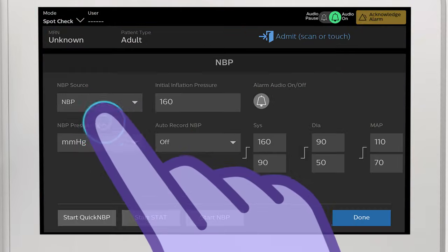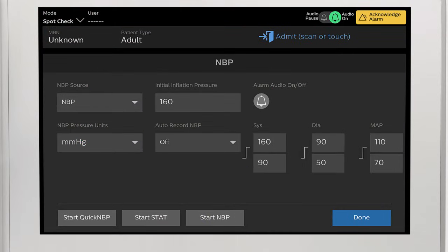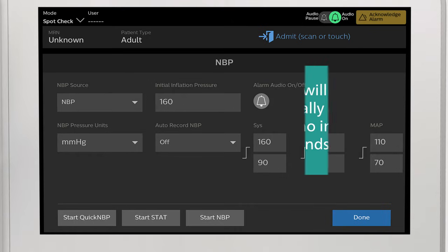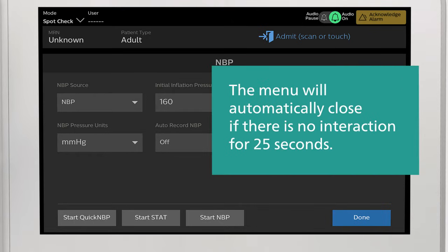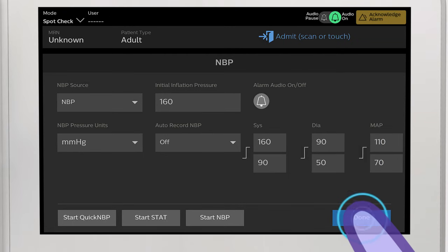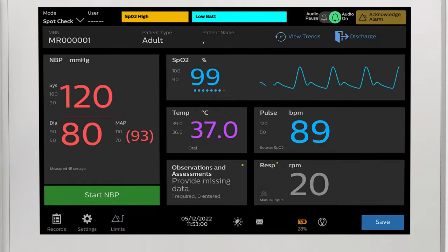Touch a measurement to view additional settings, including high and low alarm limits that can be adjusted based on your institution's policies and procedures. When finished, touch Done to return to the main screen.